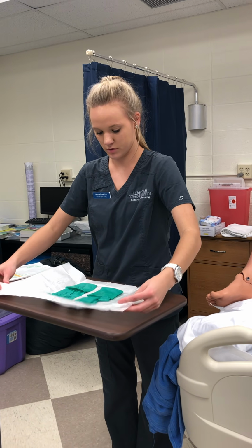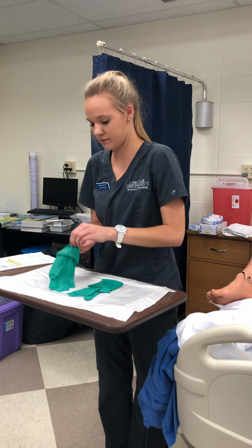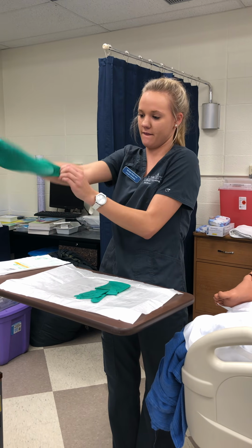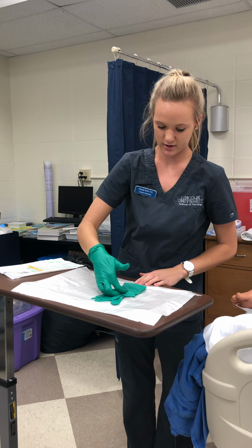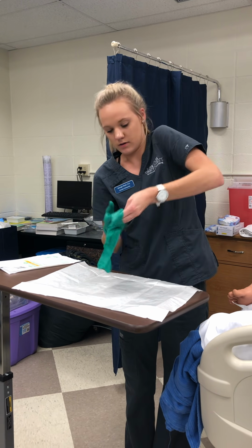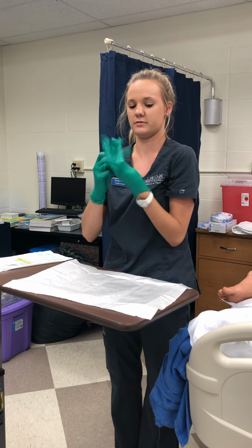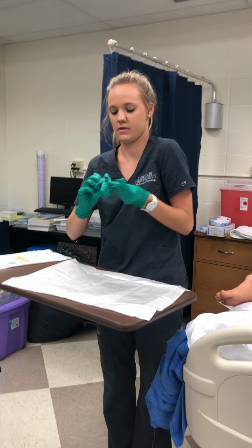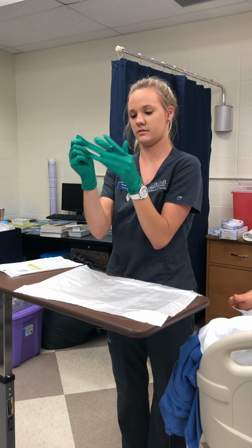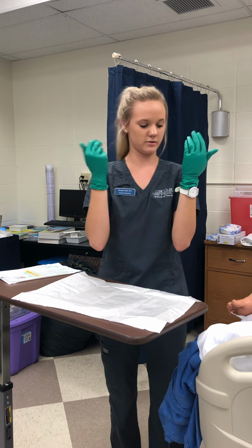I have a 1-inch border. So I do my dominant hand first. And leave it, and then my non-dominant hand. Okay, I'm gonna go ahead and fix my glove. It got really turned around here. Perfect. Okay, now I'm gonna leave it because I don't want to touch the bottoms.